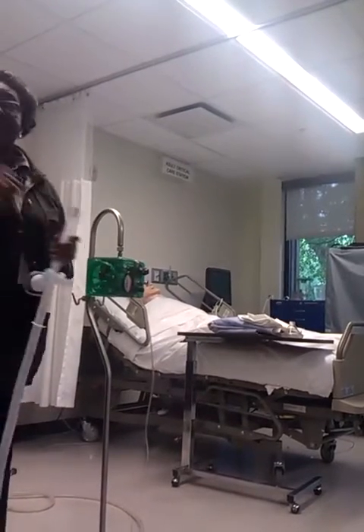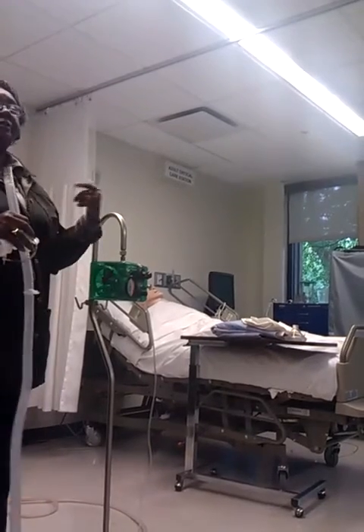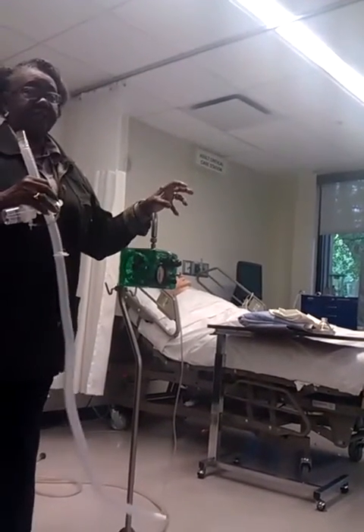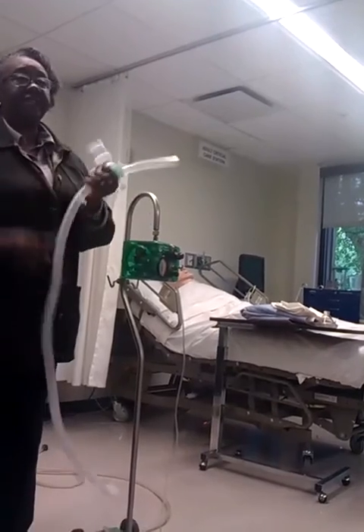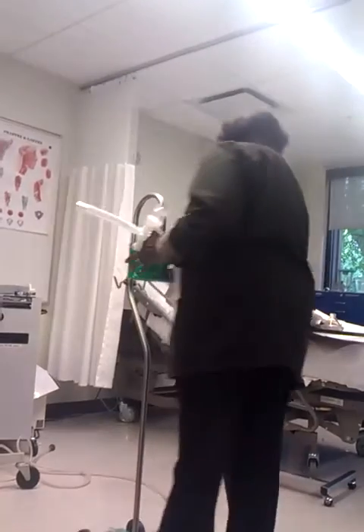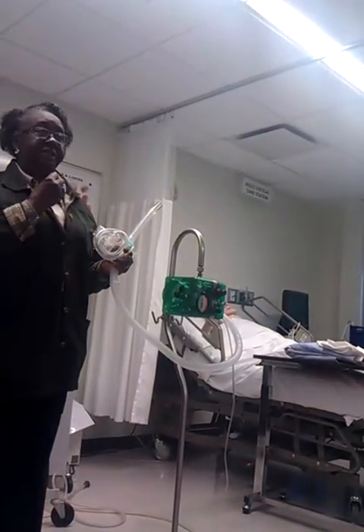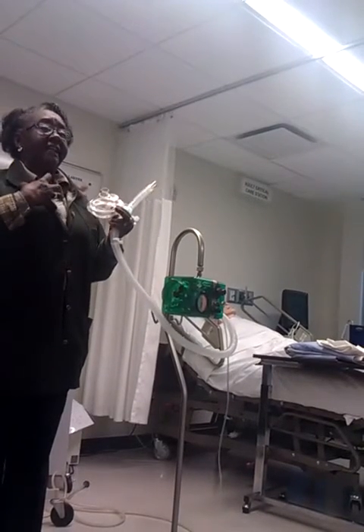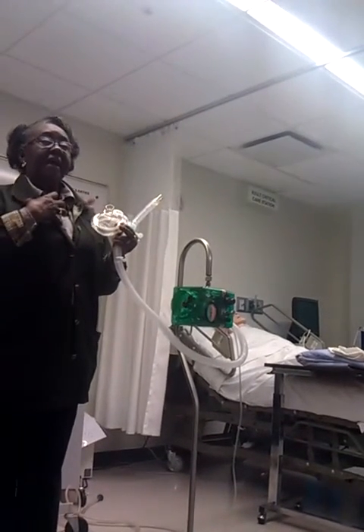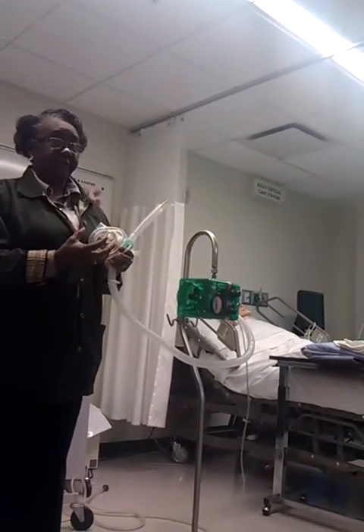You can use this device with a mouthpiece. If the patient is lucid enough to hold it in their mouth, you're going to tell your patient, first you're going to do a complete assessment. And part of that assessment will be getting a tidal volume, maybe a minute ventilation, a vital capacity, to see how well your patient's breathing. You're going to tell them that you want them to just suck in a little bit to trigger the machine and then to relax and let the gas blow into their lungs. And then, as I said, when it finishes filling their lungs, exhalation is going to be passive.